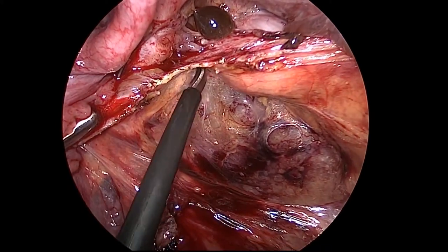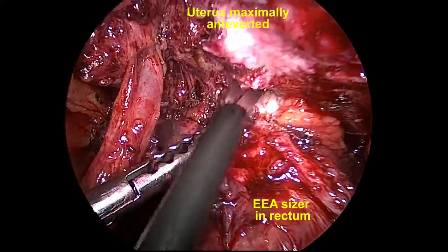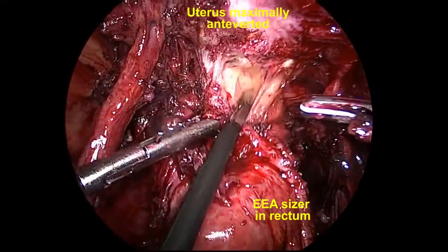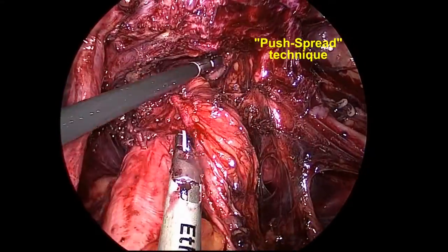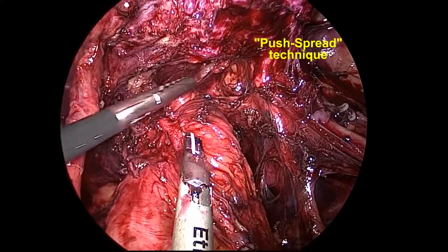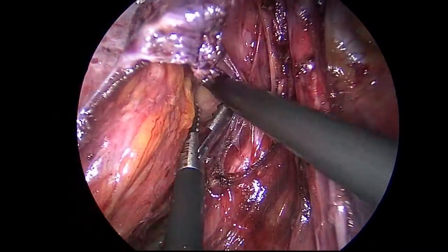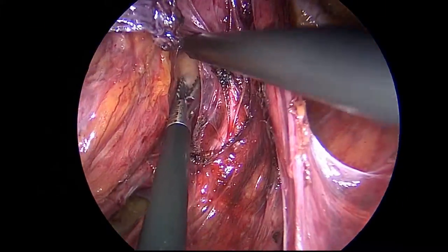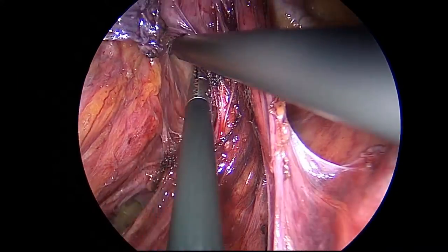The lateral approach is particularly useful when the space is obliterated in cases of endometriosis or adhesive disease. A uterine manipulator is used to maximally antivert the uterus, and an instrument such as an EEA sizer can be inserted in the rectum to aid with visualization. During dissection between the rectum and uterosacral ligaments, care should be taken to avoid the middle rectal artery and vein.